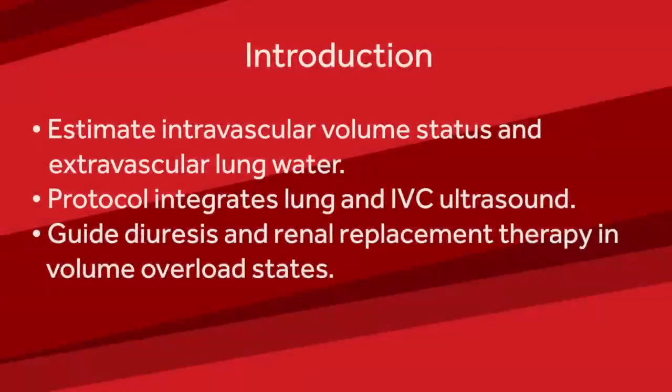The use of portable ultrasound to estimate intravascular volume status and extravascular lung water has been validated in the management of acute respiratory failure and heart failure. The literature validates the use of ultrasound for evaluation and management of fluid resuscitation and hypovolemic states. We propose a sample protocol which integrates lung and IVC ultrasound to guide diuresis and renal replacement therapy in volume overload states in specific pulmonary edema.